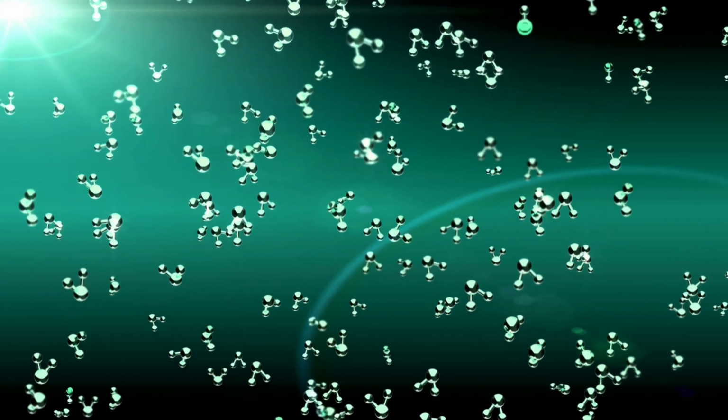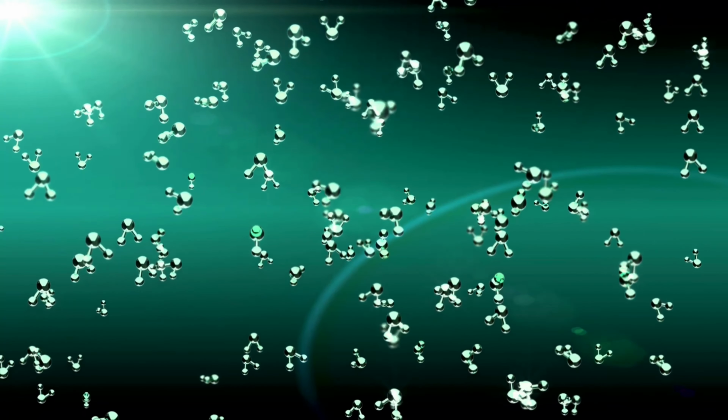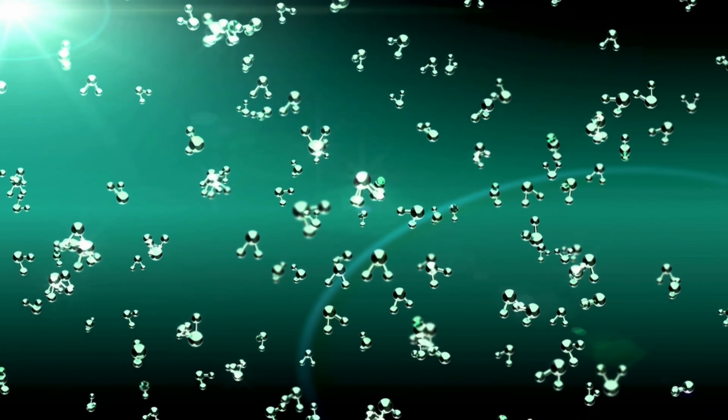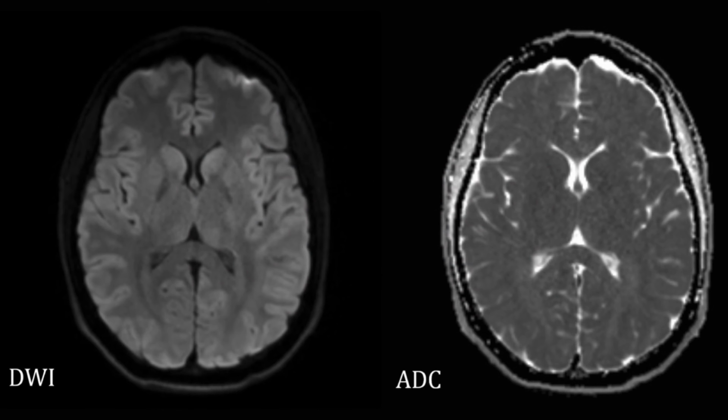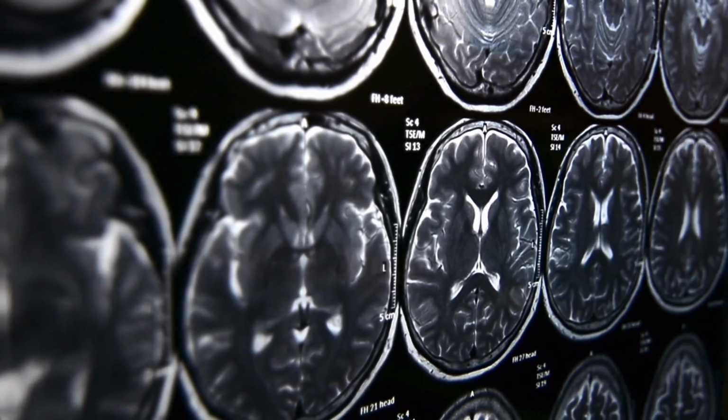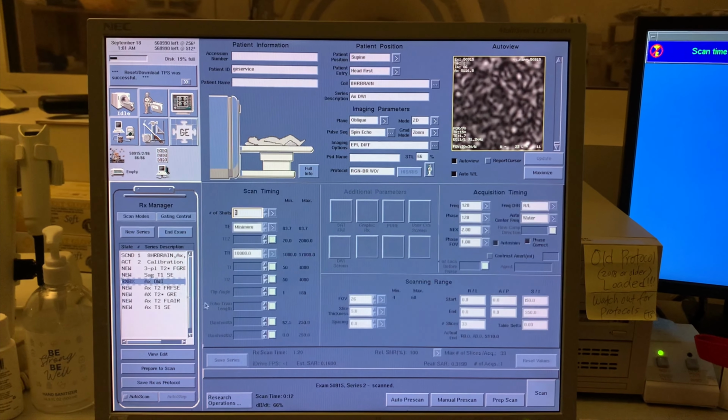The basic scan theory behind the DWI imaging sequences is that the water molecules in normal tissue diffuse in a random Brownian motion, resulting in a dark or less intense signal when overlaid with the ADC images. The molecules experiencing relatively restricted diffusion will result in a saturation of signal, or lighter images in the tissue.